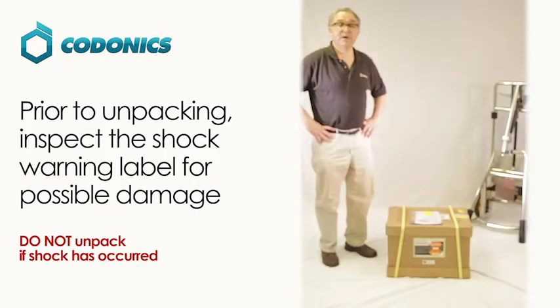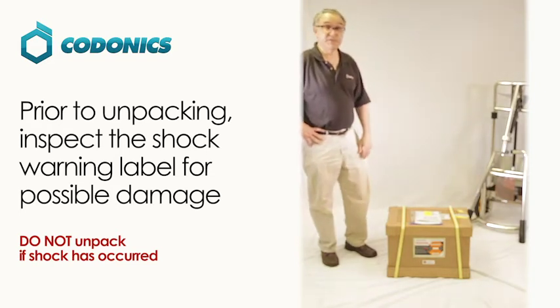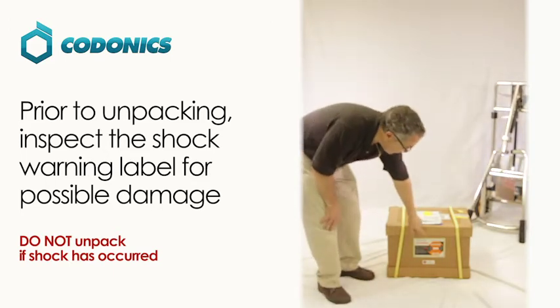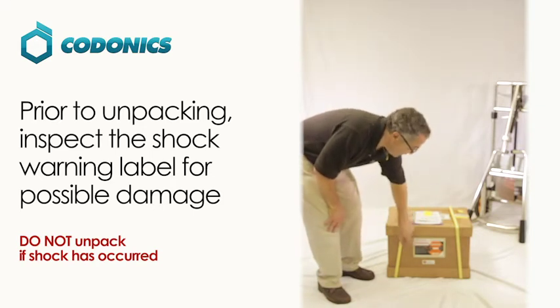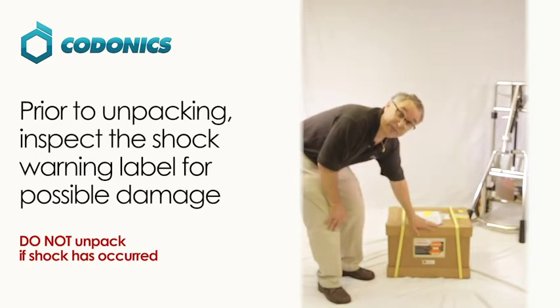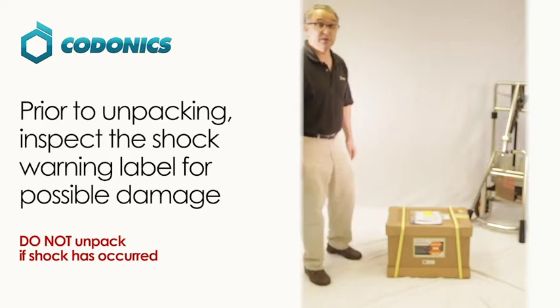Now we're going to talk about unpacking your Codontics digital portable x-ray device. When you receive your package, the first thing you should do is inspect the shock sticker on the front. If it is at all red, read the special instructions on the label on how to properly handle this shipment. If it's not red, you're ready to unpack your device.